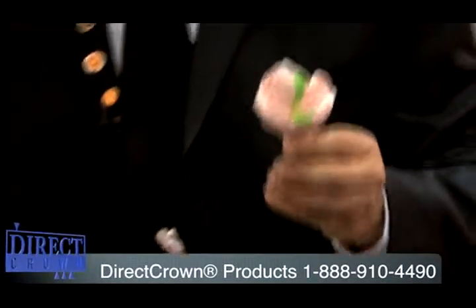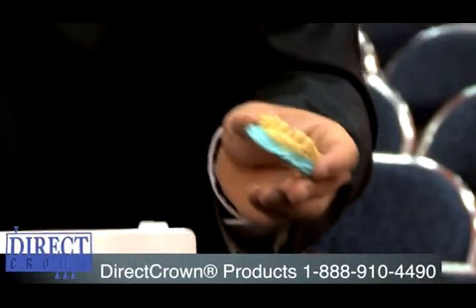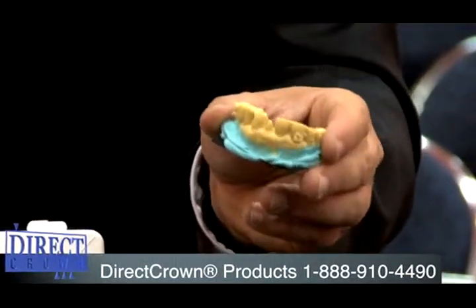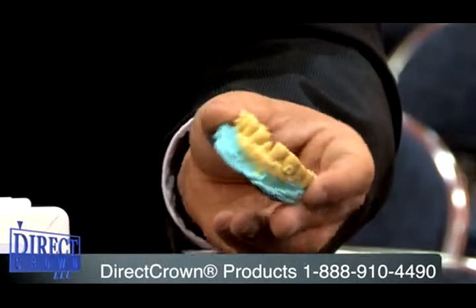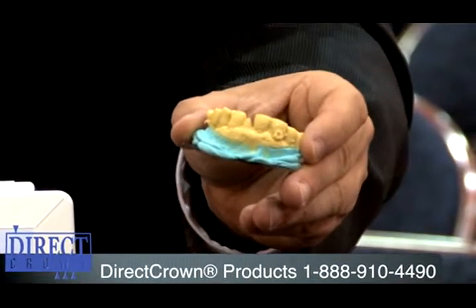You can go to more of an extraoral fabrication of the DC2 crown shell. What you would do is you'd have an alginate hydrocolloid impression, and it picks up very fine detail. Once you're done with that, you would pour it up with a vinyl poly die material. In this particular case, it's Parkell's Mach 2 and their Blue Mousse material. That gives you a model in a matter of minutes so that you can fabricate your restoration. If you're doing a posterior tooth, this was an anterior application, but if you're doing a posterior tooth, you can actually articulate the model so that you can choose the proper crown form.